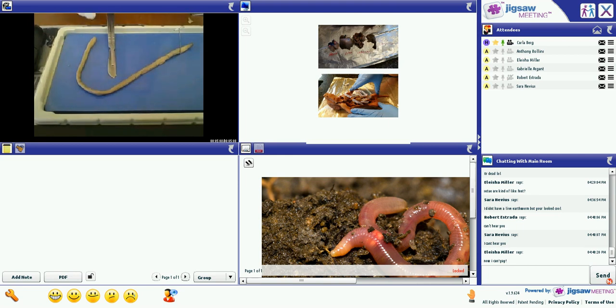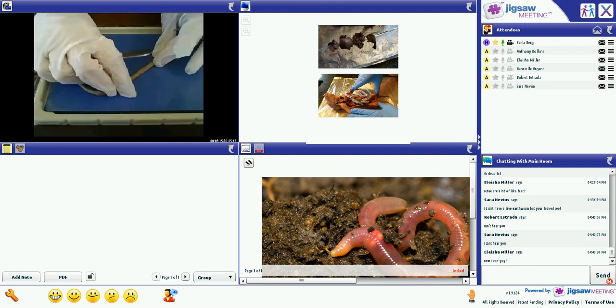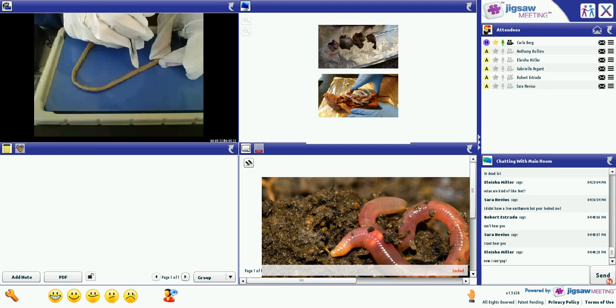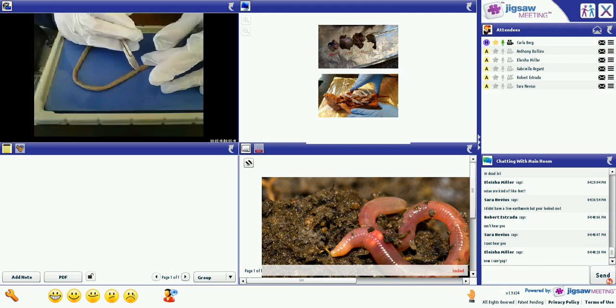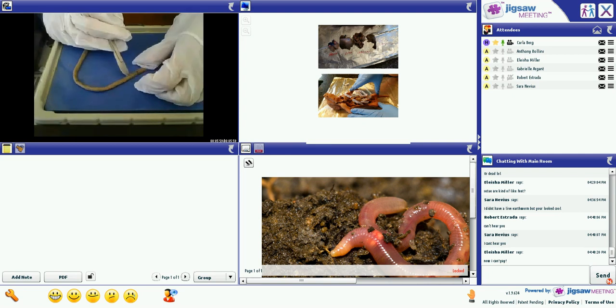So before you cut, watch me. I'm going to go about 1 inch to 1.5 inches back. My bloodline is hard to see. And you're going to cut through the muscle and see, if you look closely, I can get a little liquid to come out. That means I have made it through both the muscle and the tissue. I'm going to cut a little longer just so you can see what it looks like. You do not need that much. You just need to make a little slit.